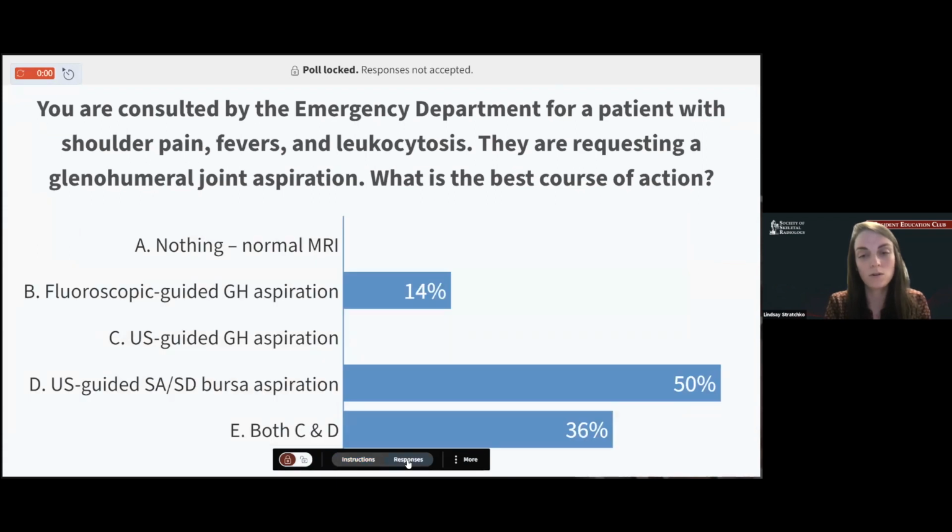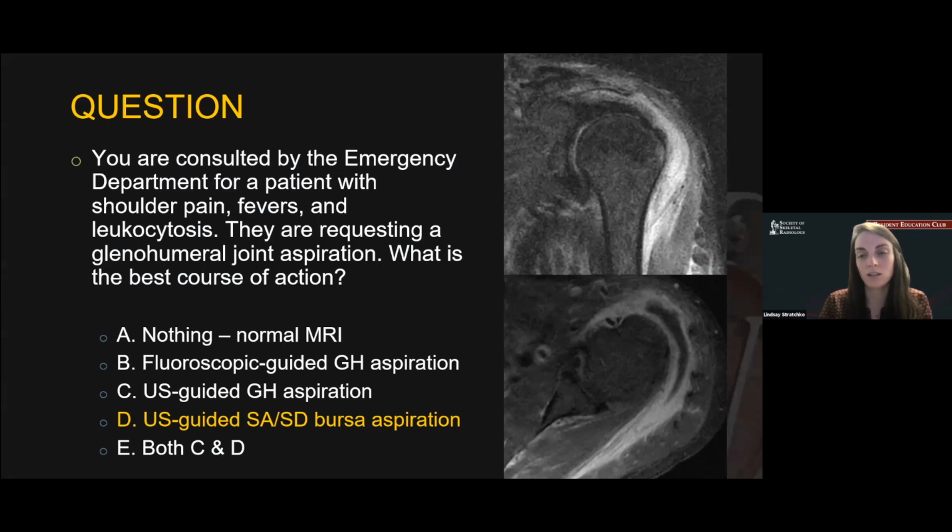All right, so slightly split, but the majority went with an ultrasound guided subacromial subdeltoid bursa aspiration, which is what I would do as well. So without further ado, we'll come into our ultrasound guided approach for subacromial bursa access.